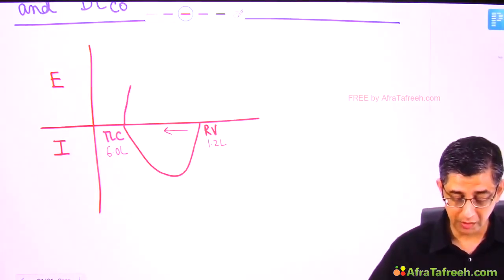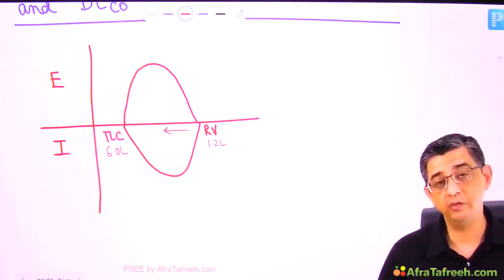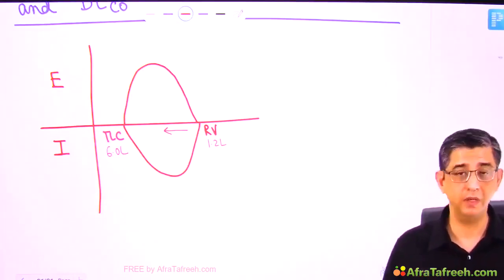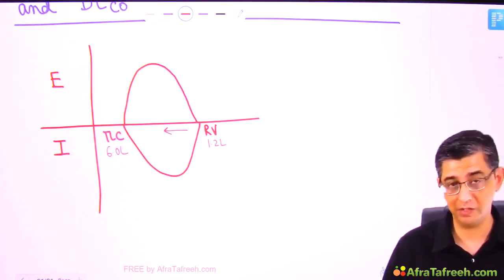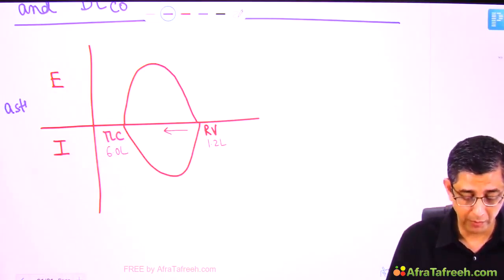So you can see that this time when the person breathes out, I've just completed the flow volume curve by here saying that the person has now only residual volume present, because obviously the lungs never collapse, there is presence of surfactant. But the flow volume curve basically helps you identify obstructive and restrictive lung disorders. And let us now see how that would actually come into shape.